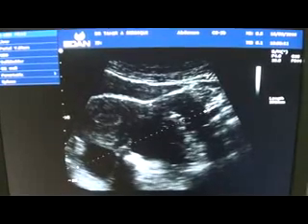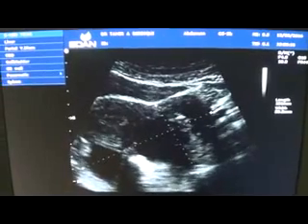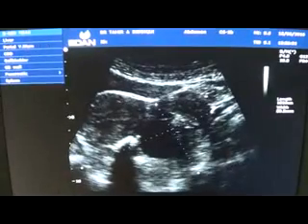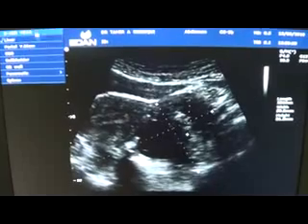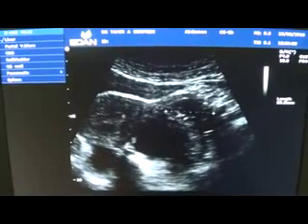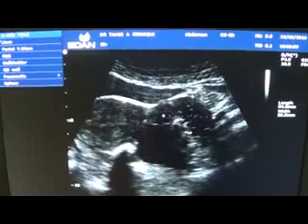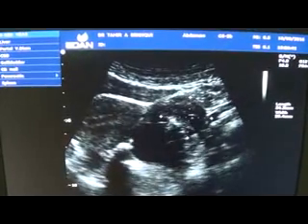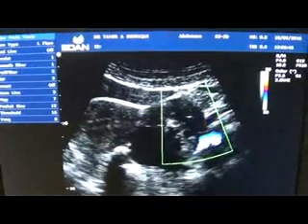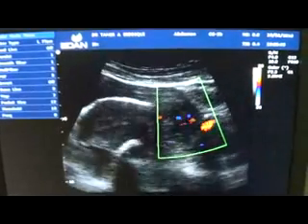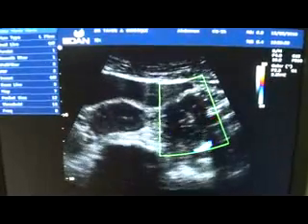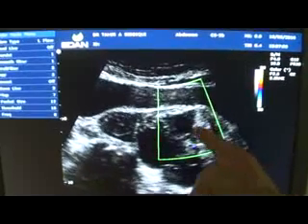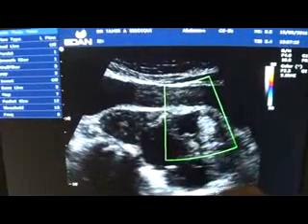This is the endometrial canal and the cystic mass measures approximately 10 cm by almost 6 cm, and here is the solid element. This is the solid element with its anterior lateral wall measuring approximately 3.4 cm by 2.9 cm. These are the vascular vessels suggesting it could be of a malignant variant. These are the vessels within the solid element of the cystic mass.